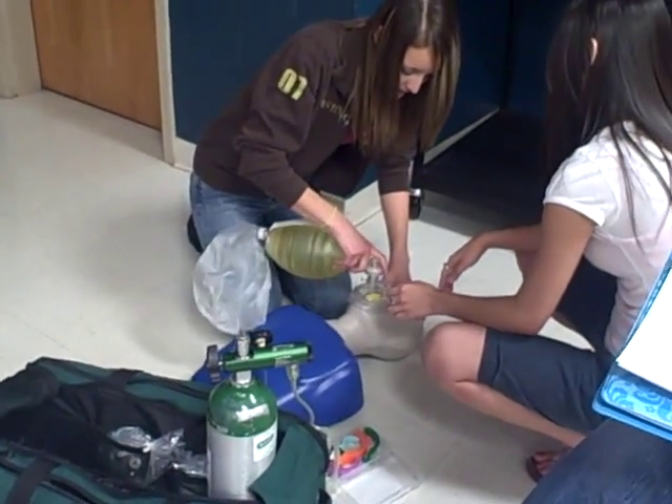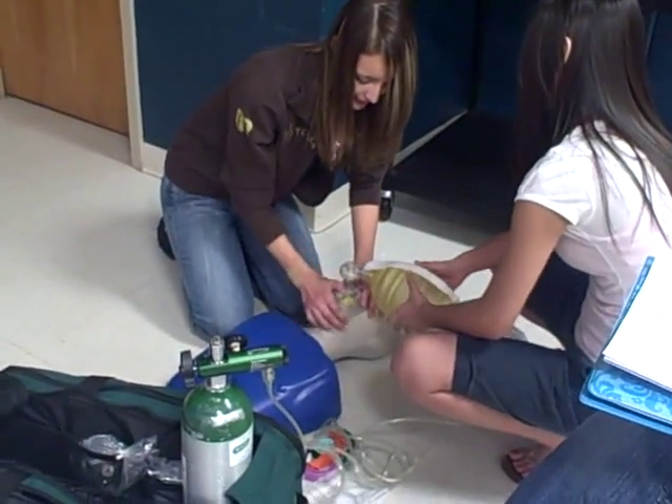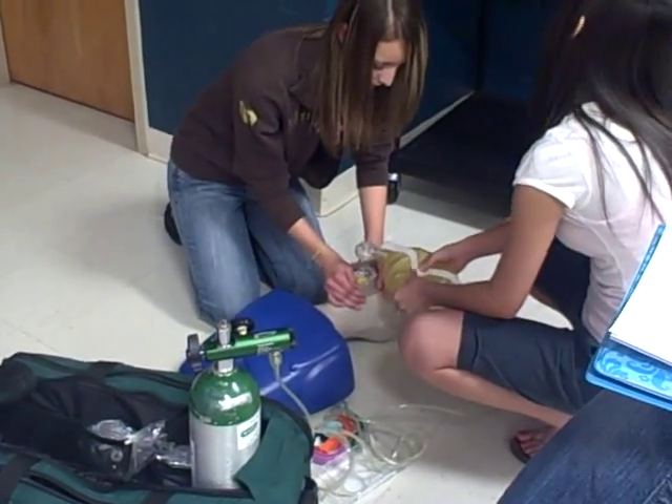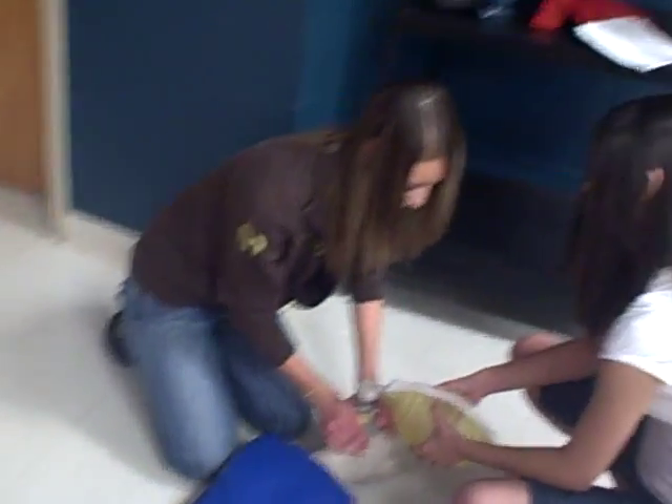Make sure the mask fits — it does. Proper seal and ventilate for 30 seconds. One one-thousand, two one-thousand, three one-thousand, four one-thousand, five one-thousand.